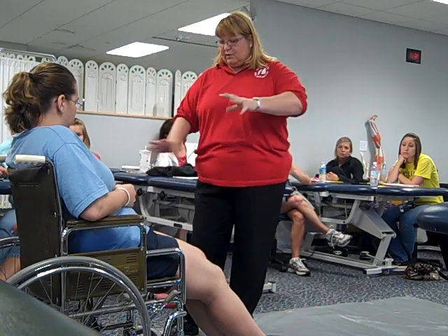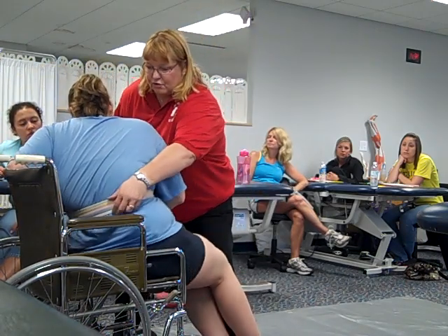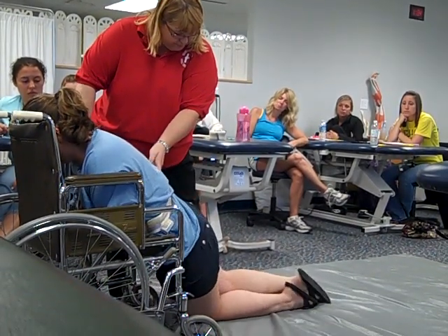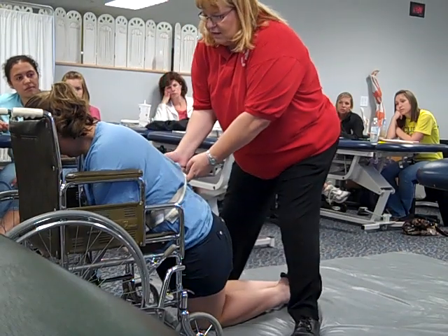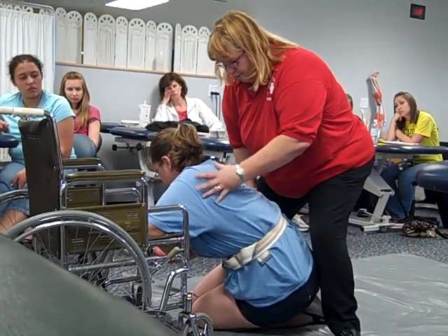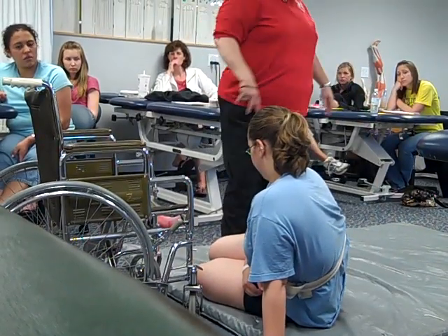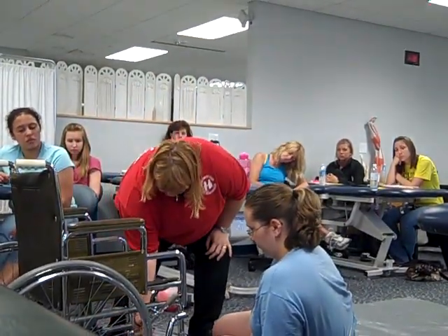Your left hand is going to be the one that's going to take your weight. The first thing we'll do is we'll turn until you get your tummy kind of resting down under the seat of the wheelchair. Go ahead and start turning at your pace here. Kind of get yourself evened up here. You can use your strong leg there to kind of get underneath you a little bit better. Keep those knees up a little further. This is your strong side, so you're going to bring yourself back until your bottom kind of sits down. Then you can put your hand down on the mat to support yourself. I would make sure she was supported — if she wasn't supported, I would lie her down before I left her. She's in a pretty good position right here.